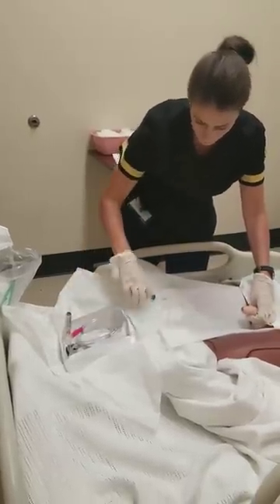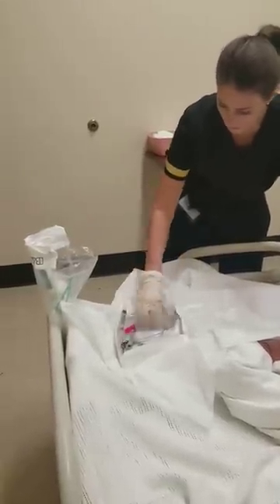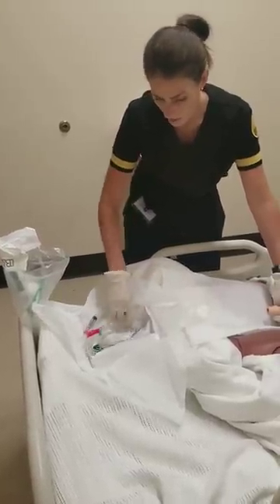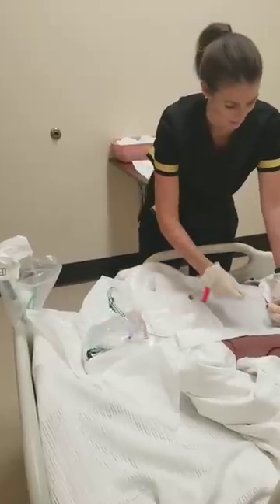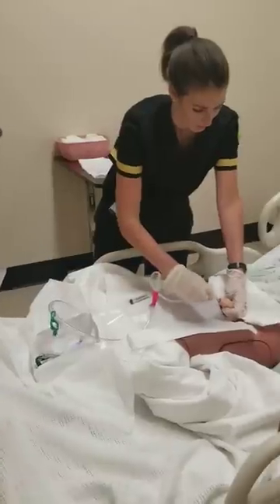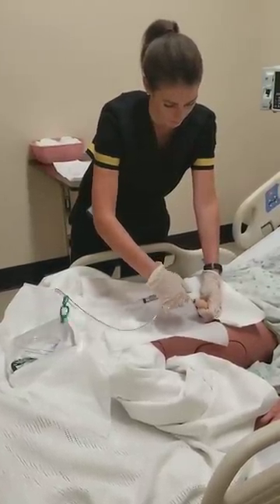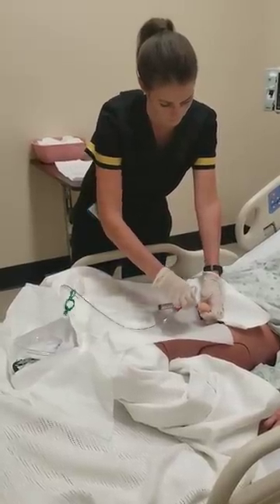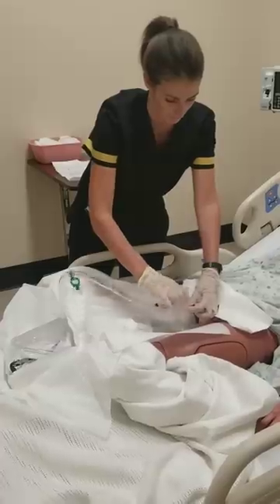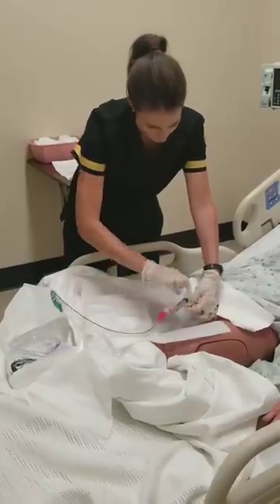Right. And I'm going to insert a little bit of lube, so you might feel a little bit of pressure. I'm just going to help everything glide a little bit smoother. Now I'm going to hold this 1 to 2 inches away from the tip, and then insert it. Okay, and we're going to inflate this balloon with 5 to 10 milliliters.